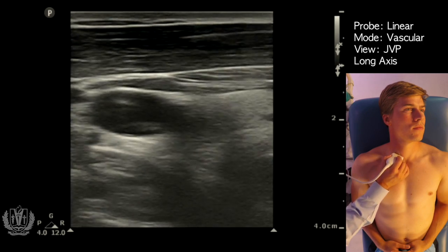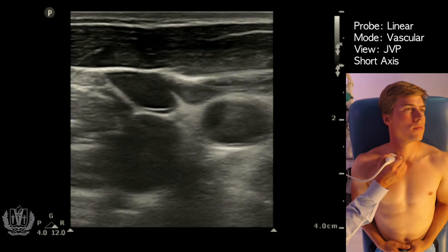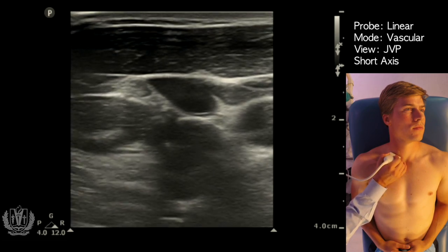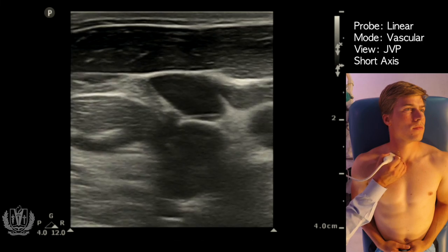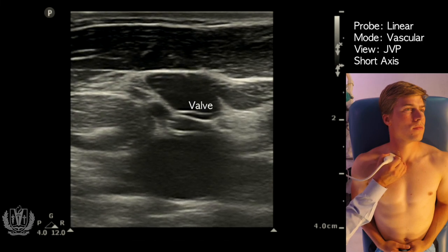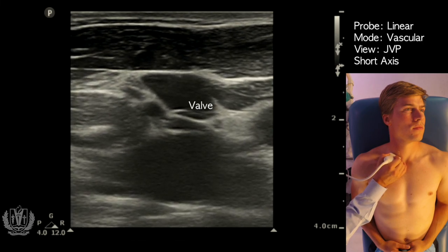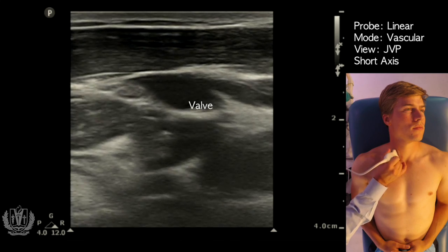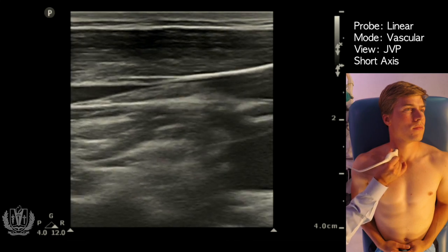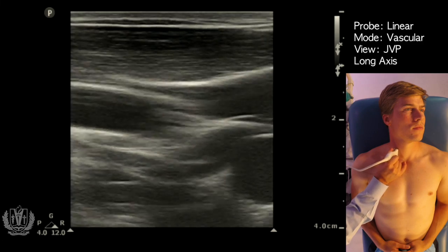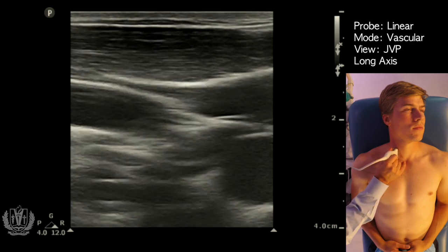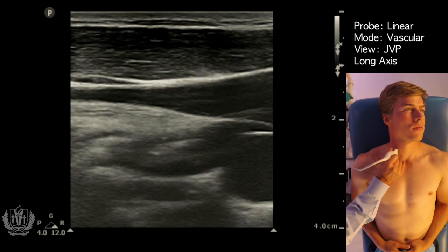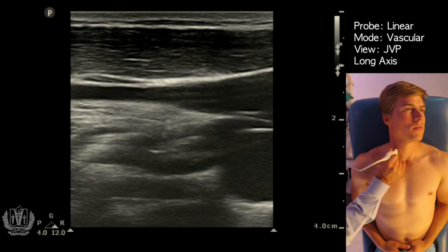Going back to the short axis or transverse view, I'm now going to focus on the internal jugular vein — you can actually see a little valve there on the internal jugular vein. I rotate 90 degrees on that as well, and there is the internal jugular vein in long axis view.